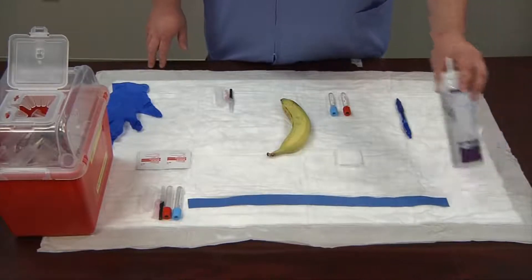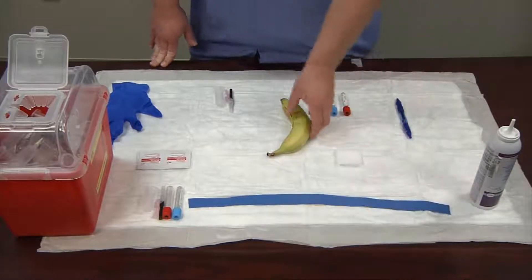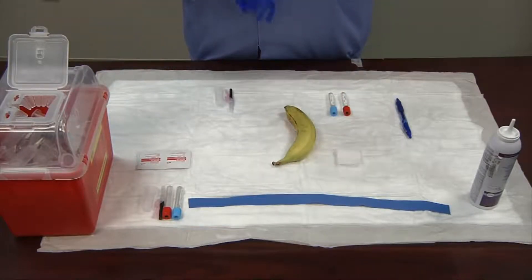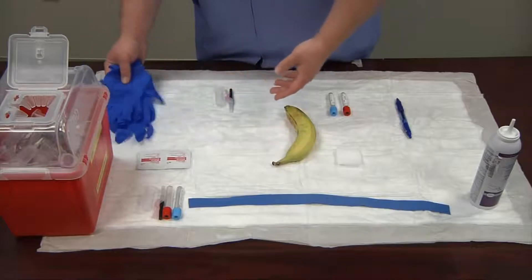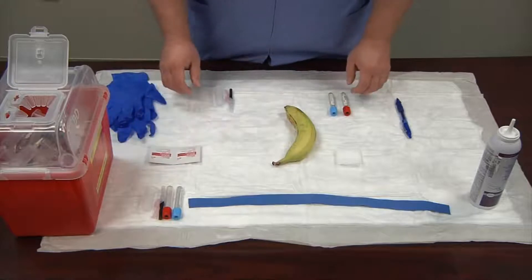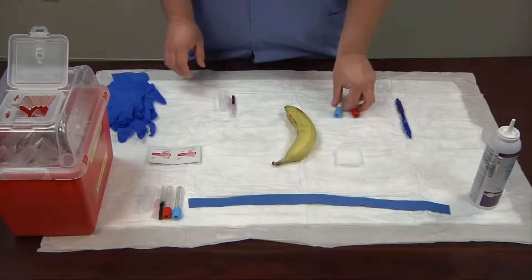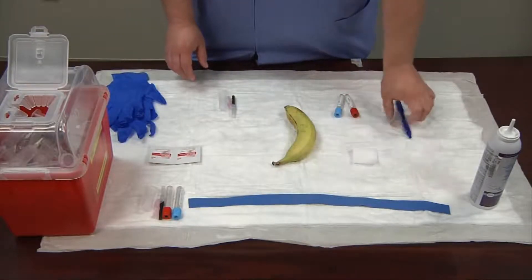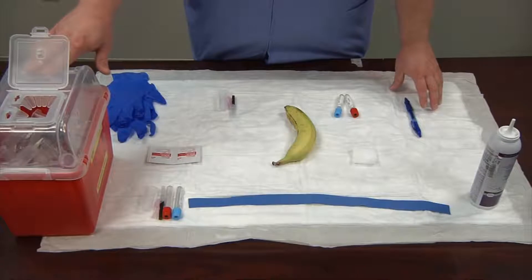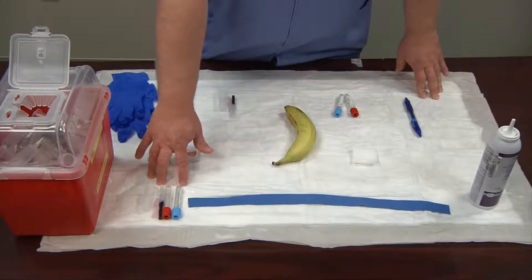The supplies you'll need to do a banana blood draw: hand sanitizer, your tourniquet, your banana (preferably a green one), your PPE — in this case gloves — your alcohol swabs (70% isopropyl alcohol), your vacutainer needle and tubes, 2x2 gauze, and a pen to label with when you're done. You'll also want your biohazard box nearby in arm's reach, and an extra needle and set of tubes in case of complications or a loss of suction.